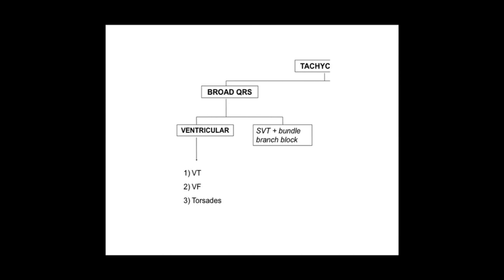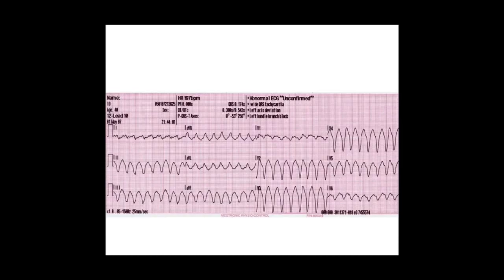Ventricular tachycardias can be broken down into VT — ventricular tachycardia — or VF — ventricular fibrillation — and torsades de pointes, which can occur as a result of long QT syndrome and describes a pattern of alternating amplitude in the QRS complexes. Here is an example of a ventricular tachycardia where you can see the rate is increased and the QRS complexes are wide and regular — a good example of a ventricular tachycardia.